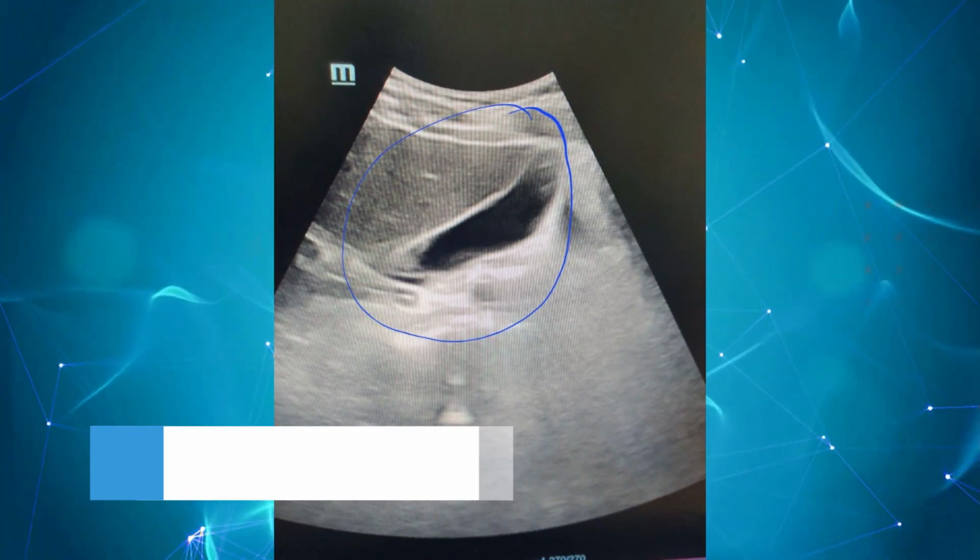So once you have these symptoms, you'll go to the hospital to see what exactly the problem is, and you'll be told to do a scan. One will do a scan called an abdominal scan, or sometimes it will be so specific, we just go ahead and do a hepatobiliary scan. And what is a hepatobiliary scan? We just want to look at the liver and the biliary tree to make sure that those structures, the liver, the gallbladder, the pancreas, with the biliary radicals, are normal.